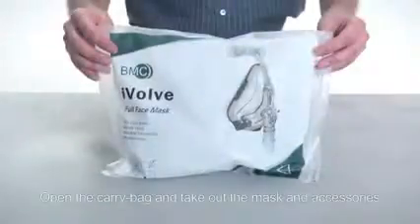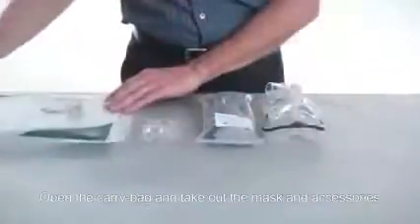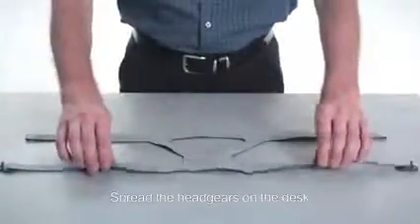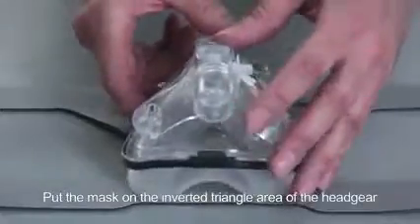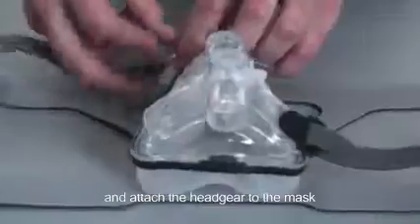Fitting: Open the carry bag and take out the mask and accessories. Spread the headgears on the desk, making sure the glossy surface is upward. Put the mask on the inverted triangle area of the headgear and attach the headgear to the mask.